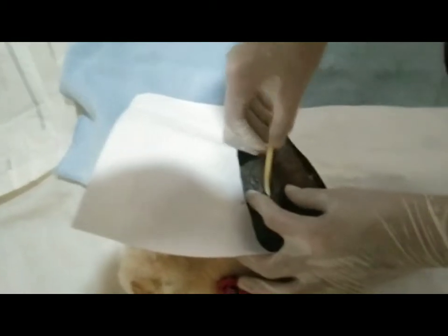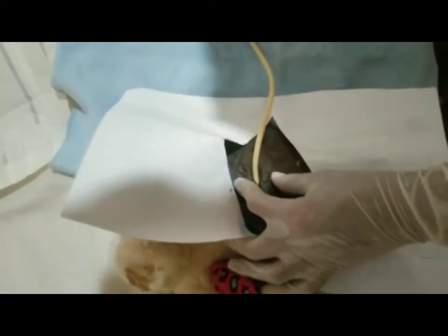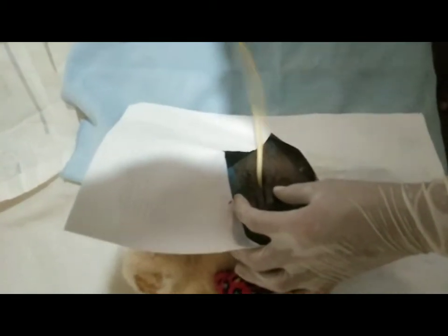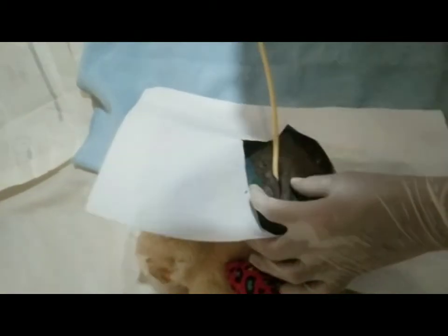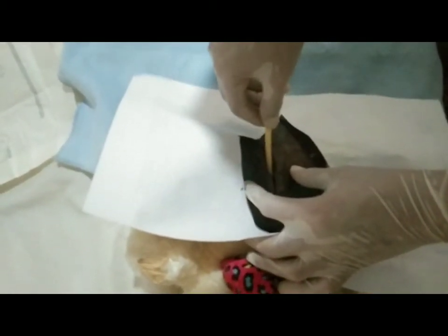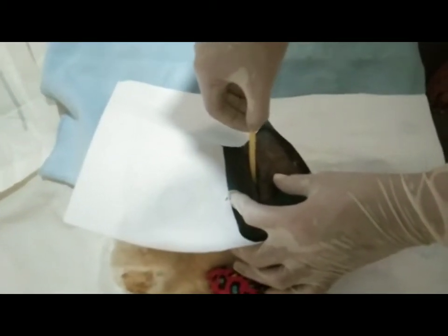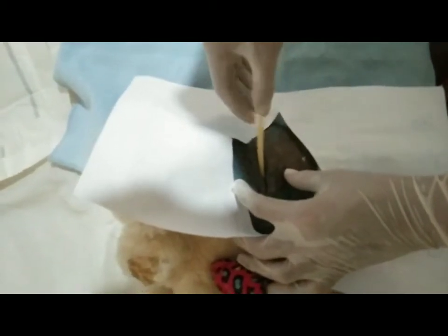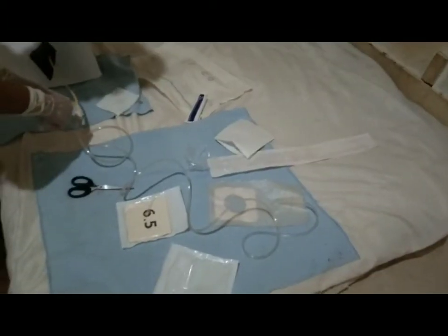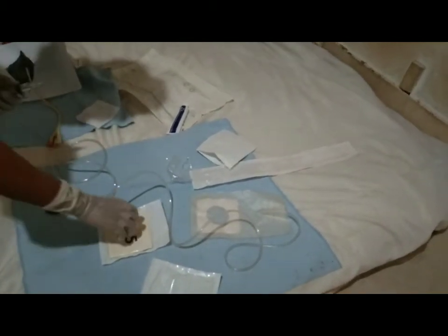So okay, and now we will inflate the balloon. We will now inflate the balloon. So okay, so we already inflate the balloon and gently pull it to know that the catheter is in the bladder. So okay, medyo sealed na siya. And now, so we will now remove the syringe and dispose it.